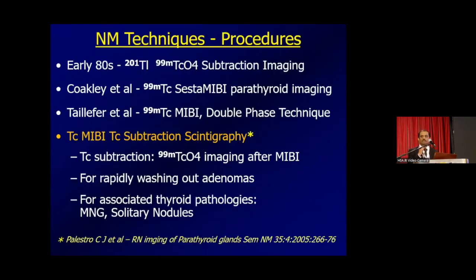So let us go through some of the established nuclear medicine procedures. The imaging of parathyroid started with a subtraction image, where you take a thallium image and subtract the technetium uptake in thyroid, thereby the abnormal thallium retention in the parathyroid is considered to be parathyroid adenoma. But it is very technically challenging. Patient's cooperation is very much needed.